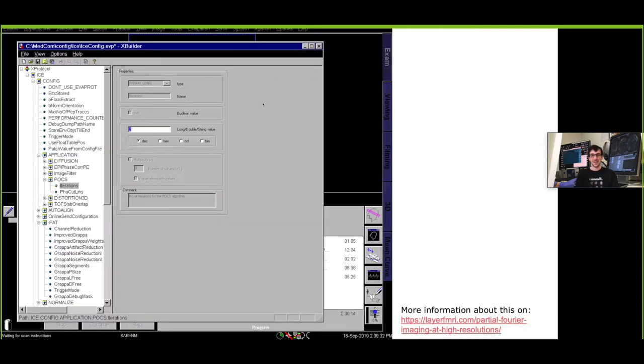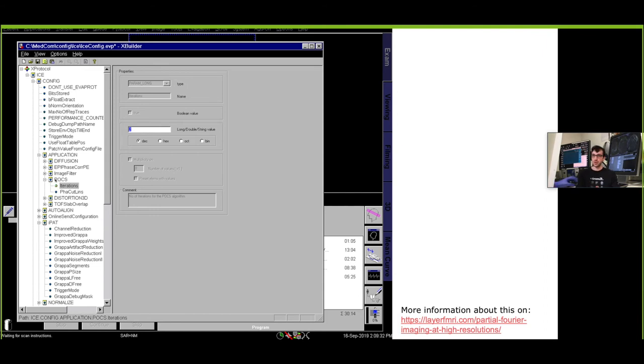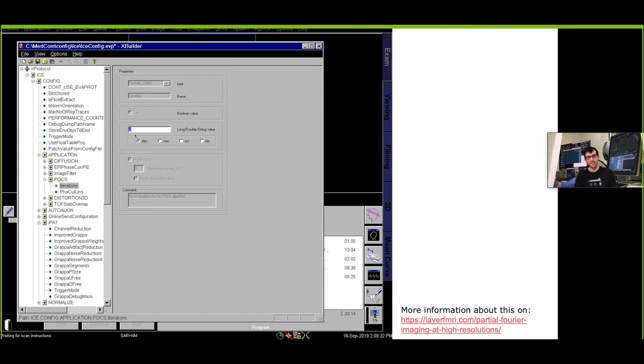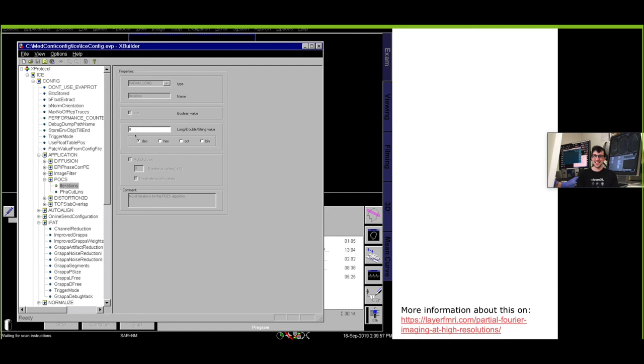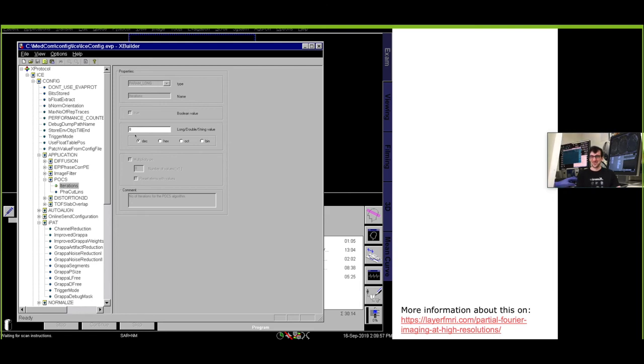Another parameter that I almost always change is here the number of iterations in the POCS reconstruction that is used as soon as you use partial Fourier imaging. POCS stands for Projection Onto Convex Sets and it's an iterative approach. The default is two iterations which often works to converge with two iterations already. However, eight iterations can help you quite a bit to be sure that you converge there and then find a good solution and it only increases the reconstruction time by maybe a few milliseconds or so. There's almost no reason not to use it.